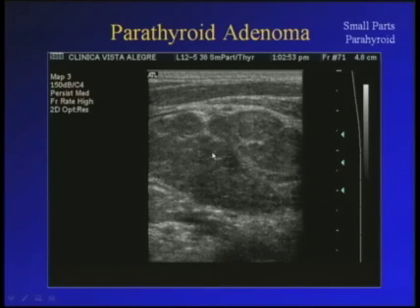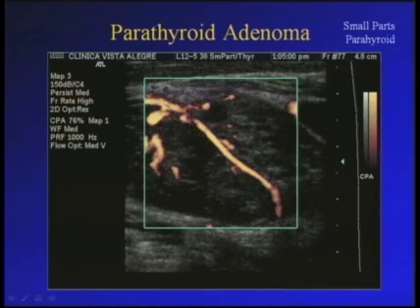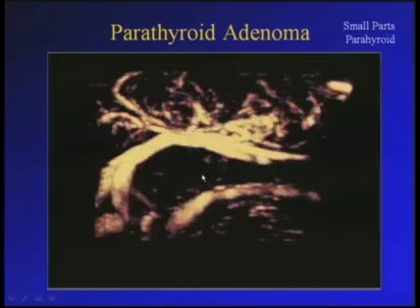This is another example of parathyroid adenoma. It's a huge lesion with the main nutritious vessels. And the same case, this is the three-dimensional reconstruction of the vascularization. With this technique, we can better determine the insertion of the vessels, which could be an important information for the surgeon.